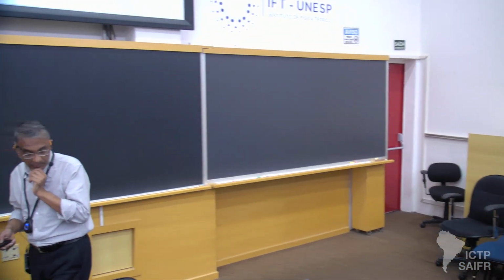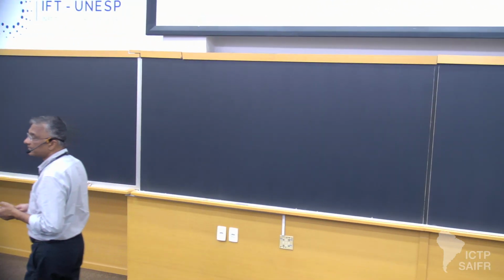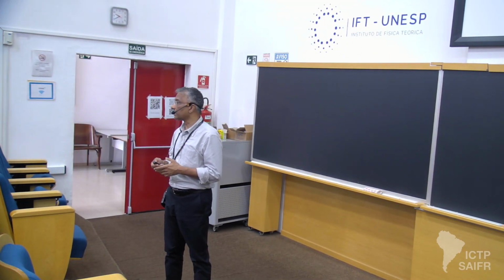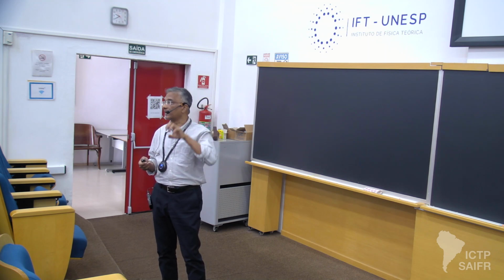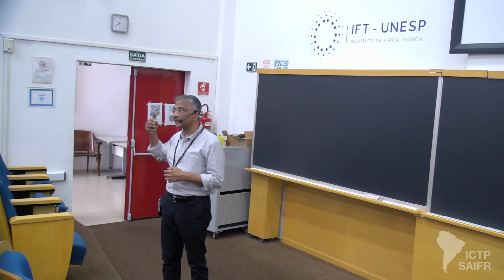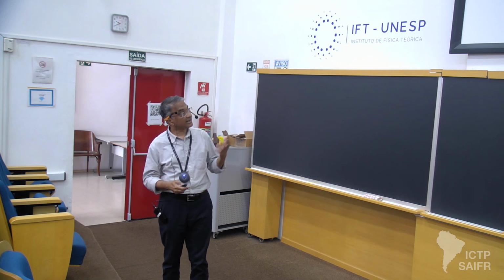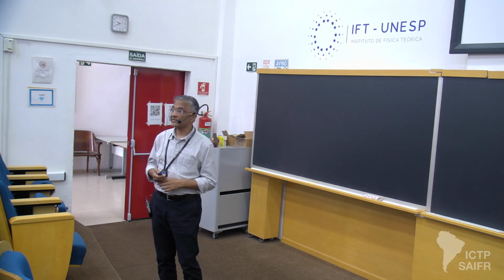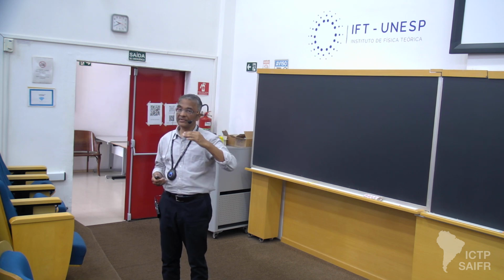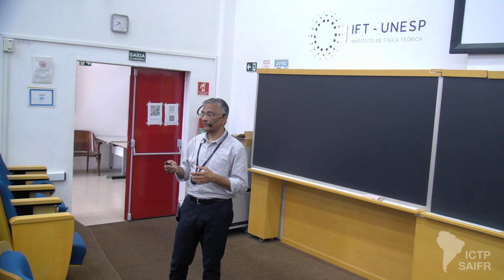So scalp EEG, well, first the EEG is a signal in general, microvolt level activity, discovered more than 100 years ago. It has a central role in epilepsy in terms of allowing us to study and make clinical decisions. Typically, we record it synchronized with video so that we can correlate the person's behavior and motions with the electrical expression. The basis of the EEG is a net voltage drop caused by a net ionic current over the resistance of extracellular space. This is an anecdotal model that we have. One of the gaps in the field that's been there since the signal was discovered is that we don't have a good model for the EEG, and this is a failure for the field overall.